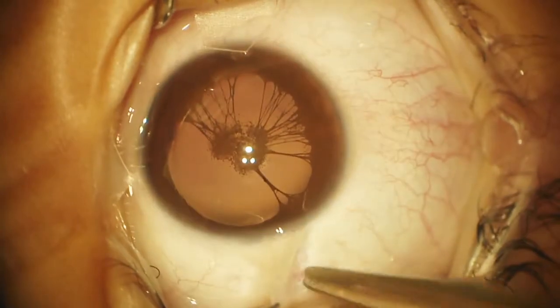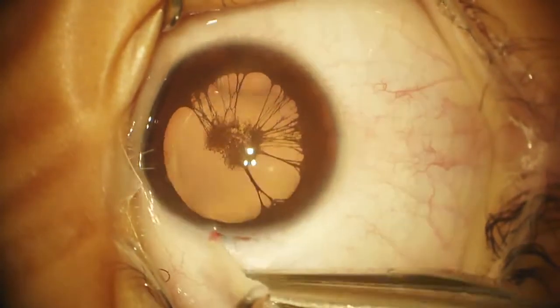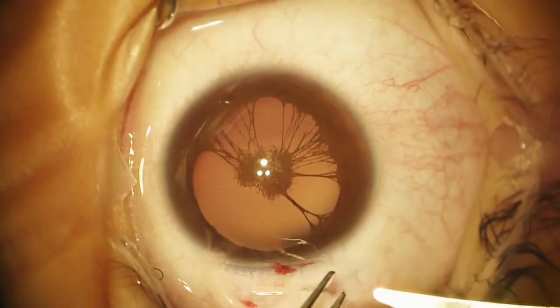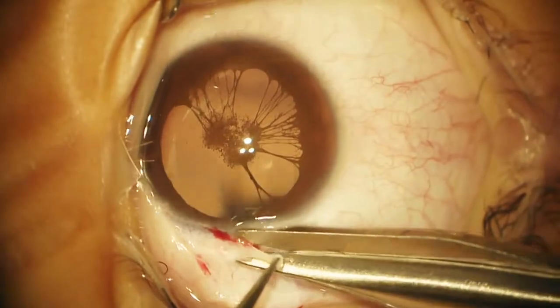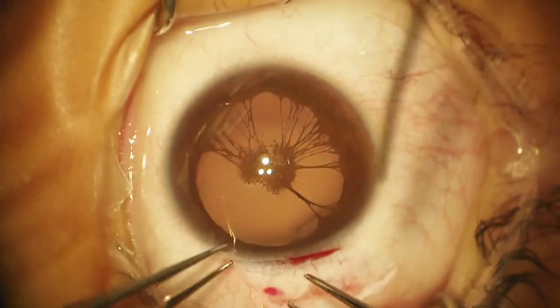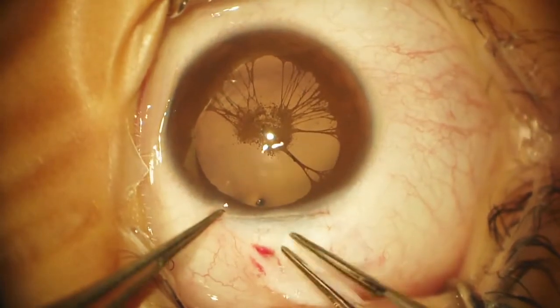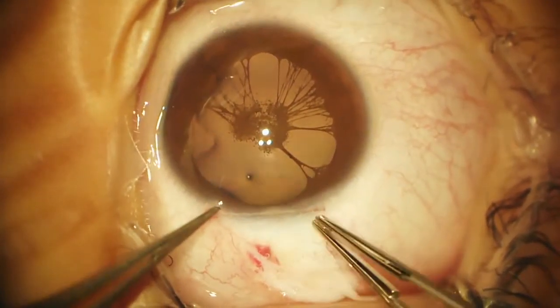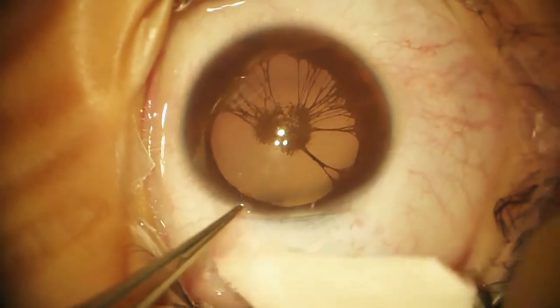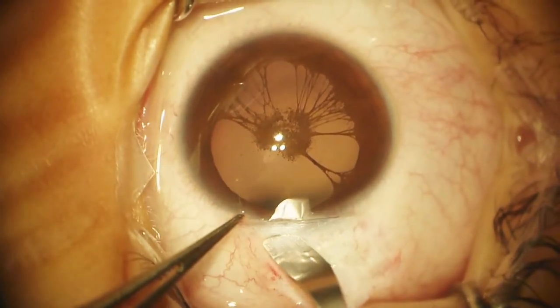Our goal is to cut the strands and perform a capsulorexis around the outside of that membrane, remove the lens, and place a focusing lens implant. The key will be to remove those without rupturing the capsule. As in all children, I perform a little conjunctival peritomy and a scleral tunnel incision, and we will plan to place a suture at the end. We'll probably make several paracenteses to allow access for our micro scissors to cut the little membrane strands.